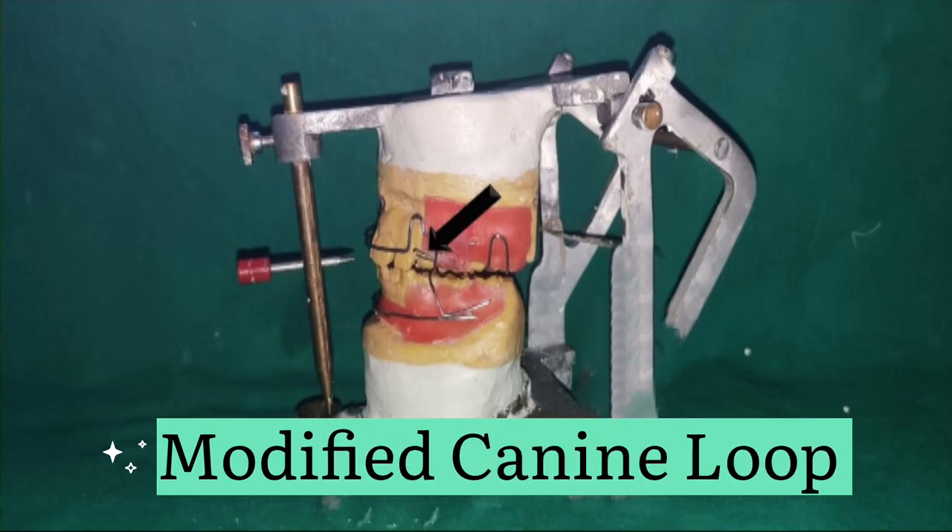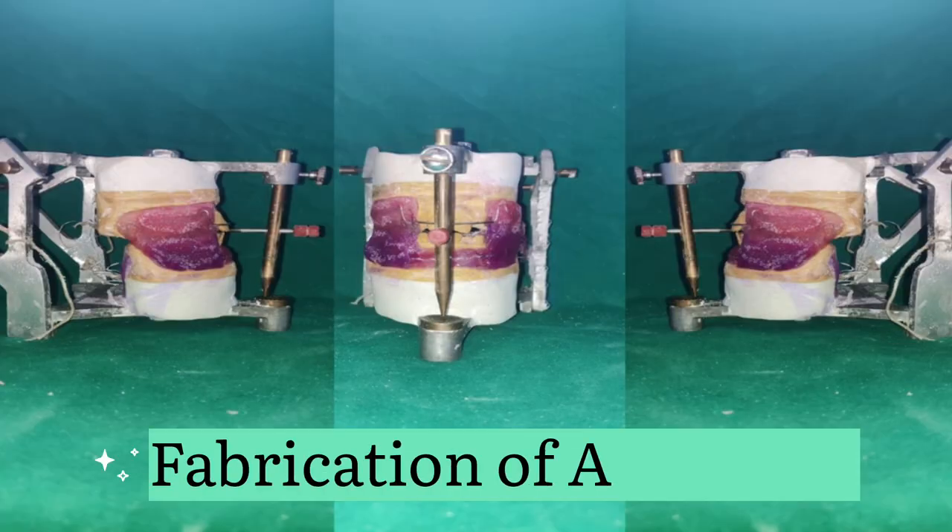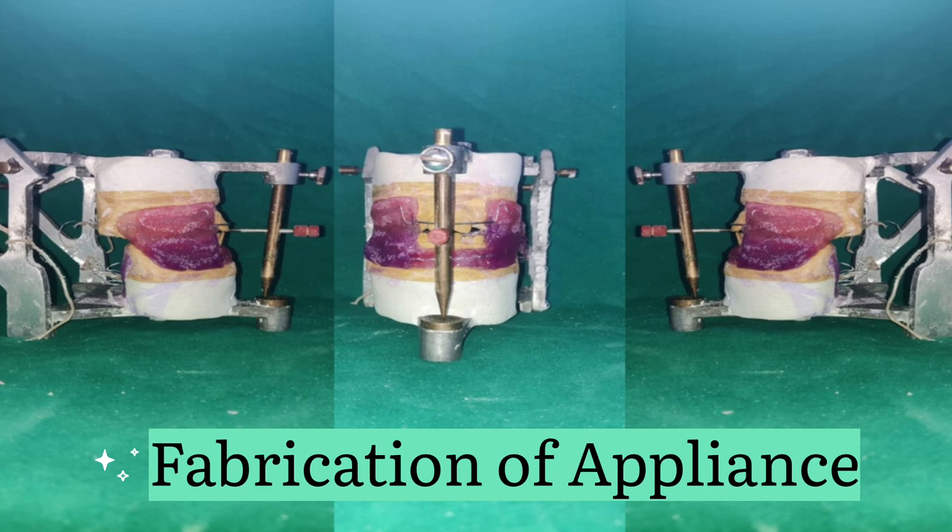The modified canine loop is utilized exclusively in the FR2 appliance. It provides function-activated pressure on the canine, resulting in corresponding tooth movement. The lower labial wire supports the lip pad in proper position; it is inverted-V in shape and prevents irritation to the labial frenum.